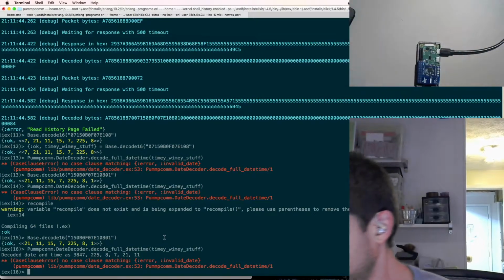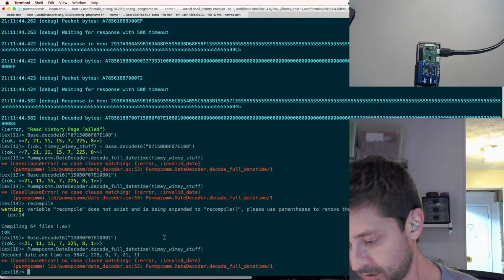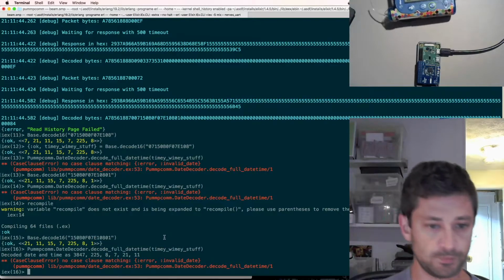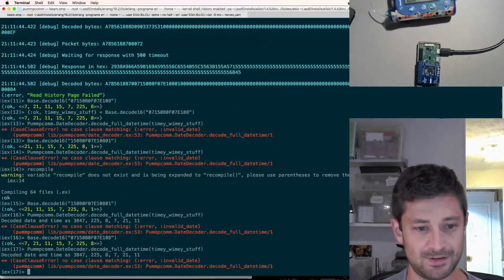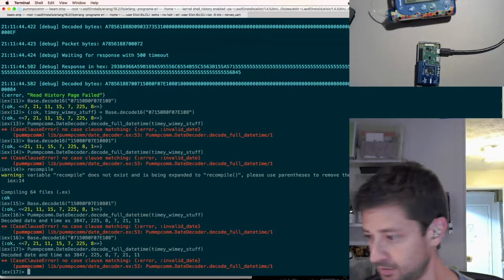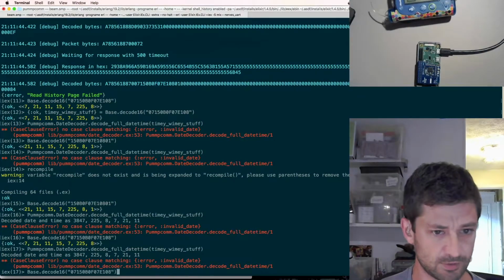7:21. That doesn't seem right at all. That doesn't look like the time on this pump. Yeah, it says it's 9:14. So that's wrong. Let's try the other one. That looks basically the same. What did I do? Did I just type the same thing in?